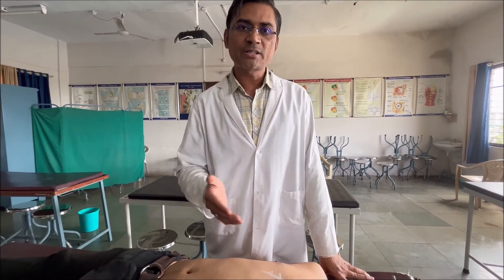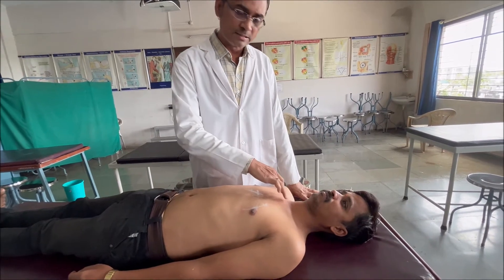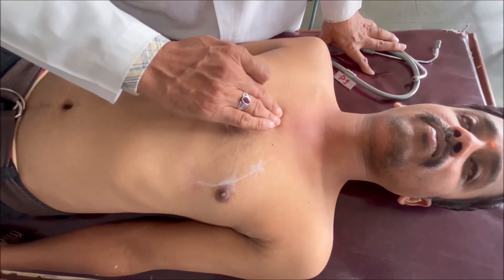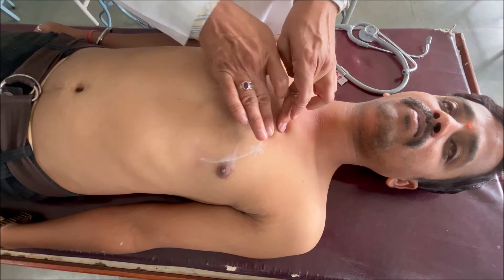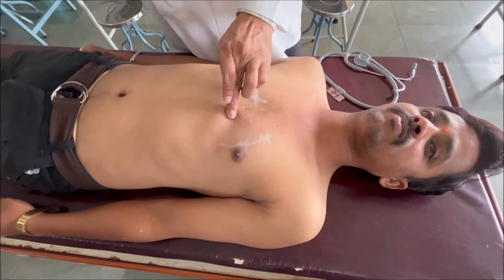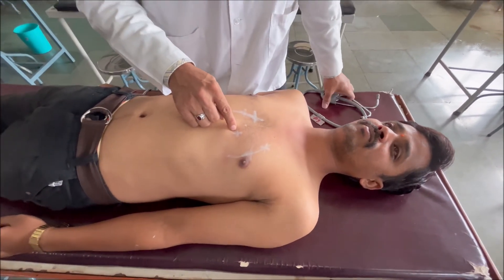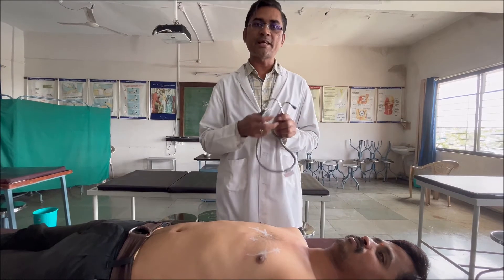Now, what about the tricuspid area? The tricuspid area is located in the left fourth intercostal space near the left border of the sternum. To find the intercostal space: start at the jugular notch, roll your finger downward till you get the first bony prominence — the sternal angle. On the left side you will get the left second rib; below it is the left second intercostal space. Then the third rib, third intercostal space, fourth rib, fourth intercostal space — this is at the left border of the sternum. This point marks the tricuspid area. Place the stethoscope here and listen to the sound.